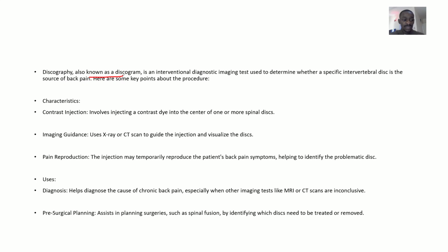Okay, some certain spinal problems accurately, in the sense that spinal problems like back pain mostly, or maybe a prolapsed spinal disc and all of that. This will help you to be able to diagnose these problems accurately. So, what is the characteristics of this type of imaging modality?